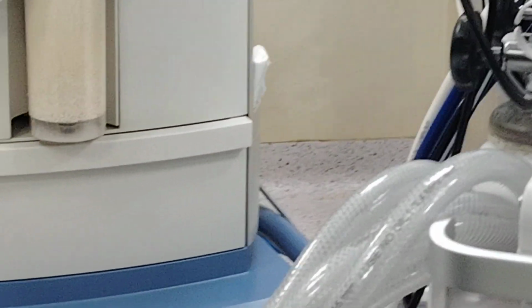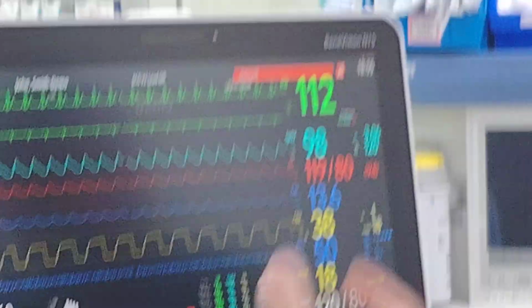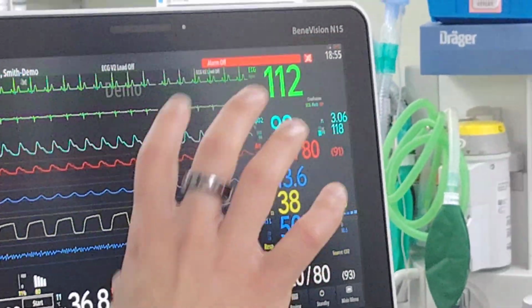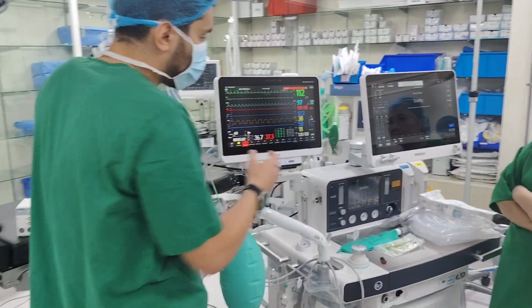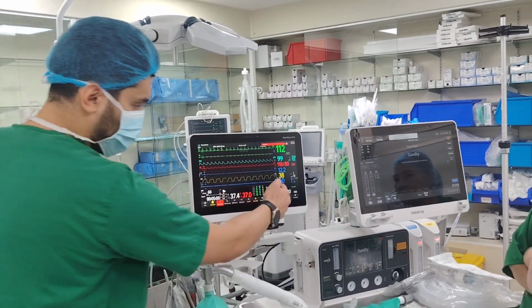Now, how do you know also if it's very good? You will see it from here, from the signal. You see, SQI is Signal Quality Index. If the quality is bad, in both ways, it will write for you here poor signal, artifacts, etc. Okay? And then you have the alarms here, which is straightforward. You know, the 40 between 60, you can change the alarm.